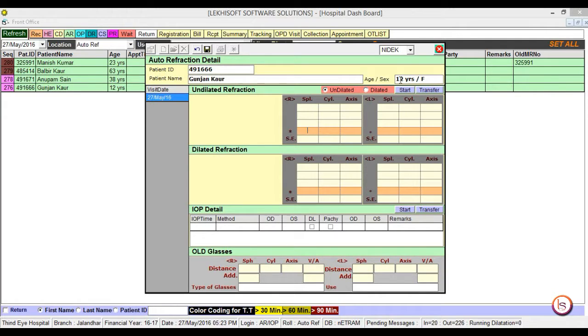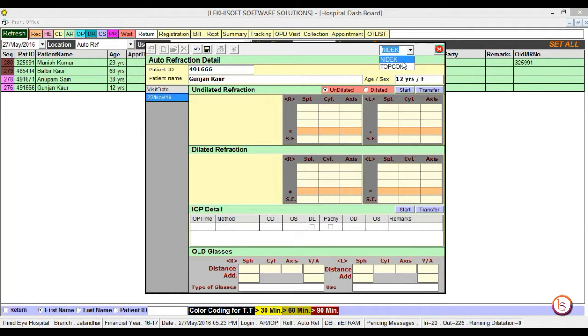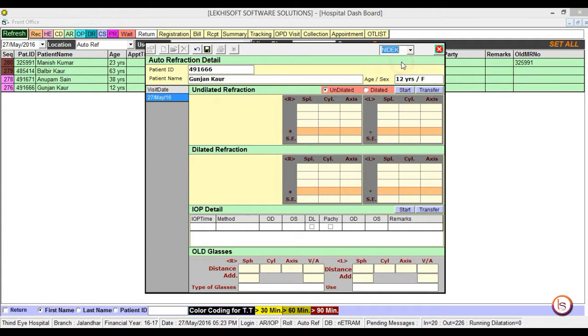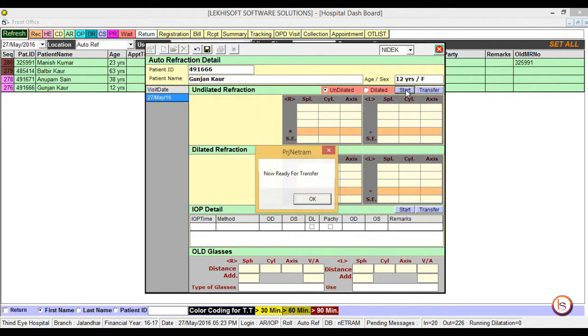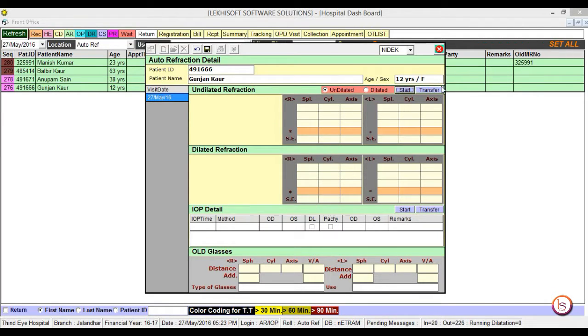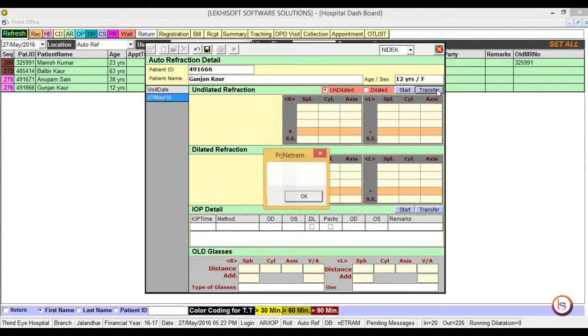In case you want to transfer the data from equipment, select the equipment, press the start button, and click on the transfer button. Then the data would be transferred.